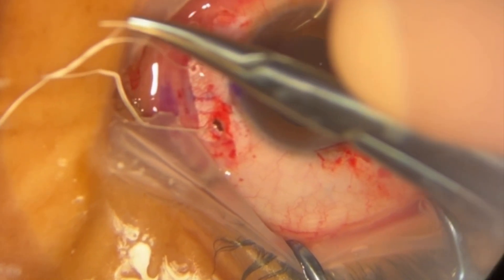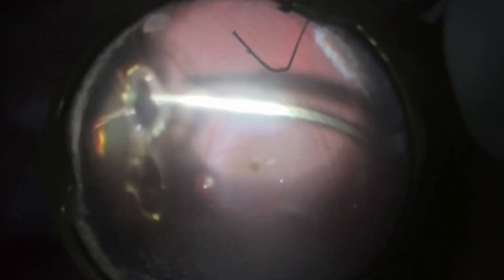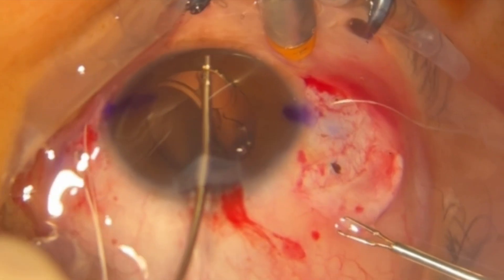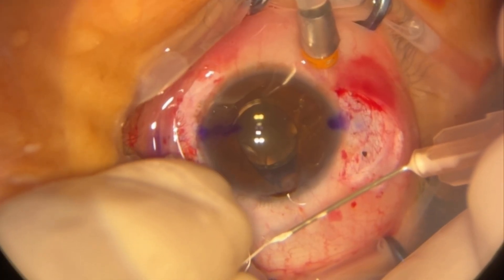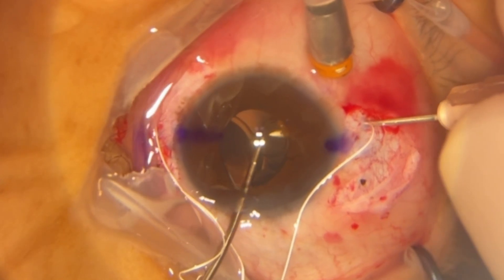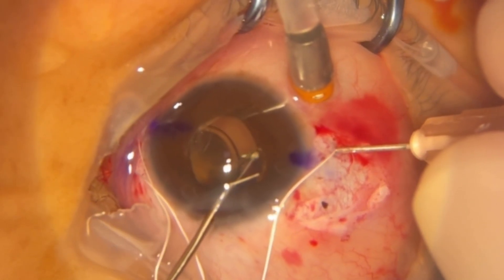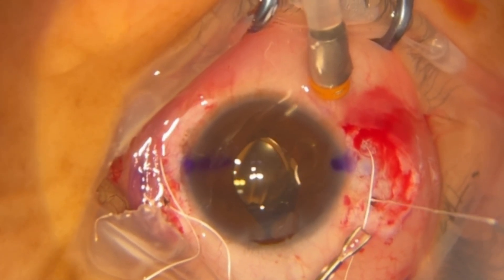The surgeon places a safety suture on the nasal side and, with the aid of forceps, positions the intraocular lens over the iris. The same process is then performed with the Gore-Tex thread passing through the loops of the intraocular lens in the anterior chamber using the 29-gauge needle and forceps.